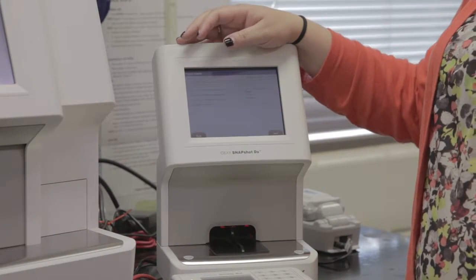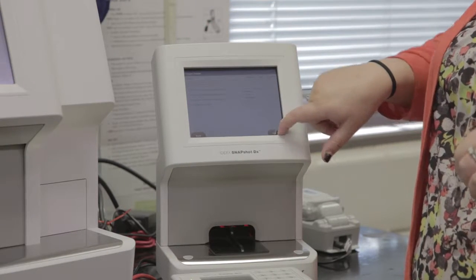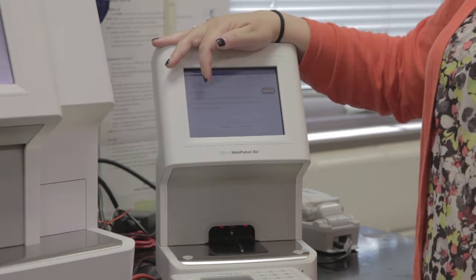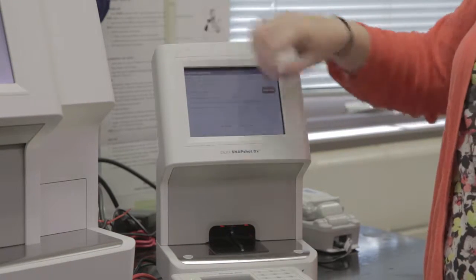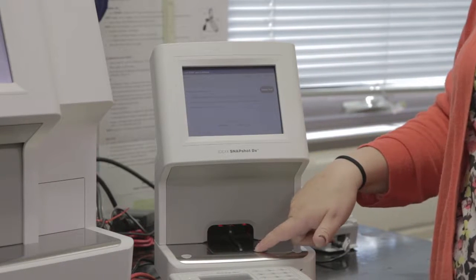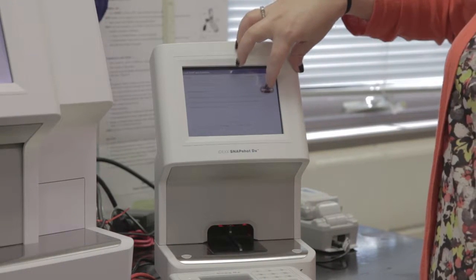So I would do that. I would then insert my sample into my SNAP test, and then once it reaches the activation circle, I would snap it down and insert it into either well. Okay, I'm going to delete that.